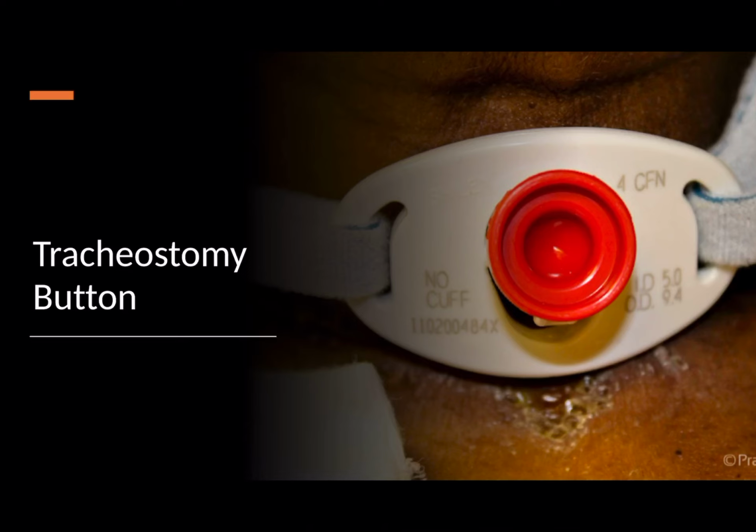Why would you want to block off the tracheostomy? Well, this is where you want the patient to be breathing through the mouth and through the nose. Air goes in through the mouth and nose, into the trachea, and then out through the mouth and nose. So you're basically getting rid of the tracheostomy completely and allowing the patient to breathe normally. This is not done that often.